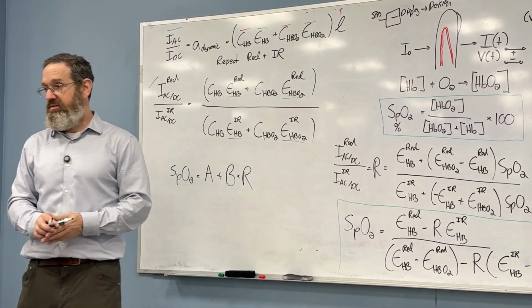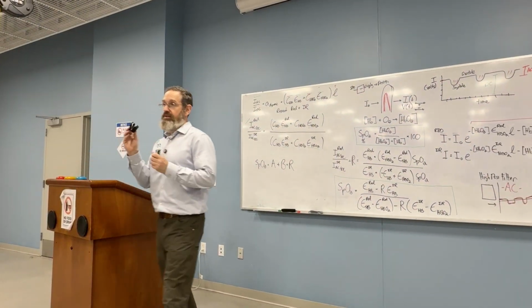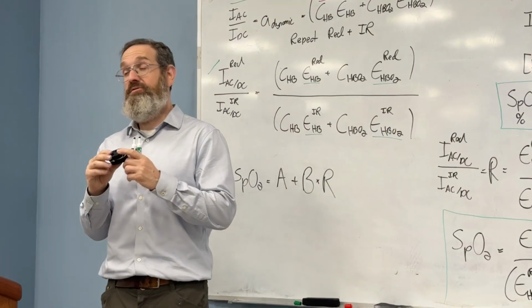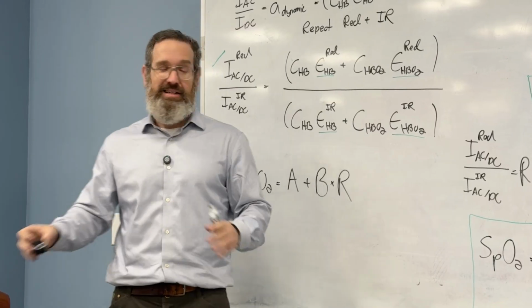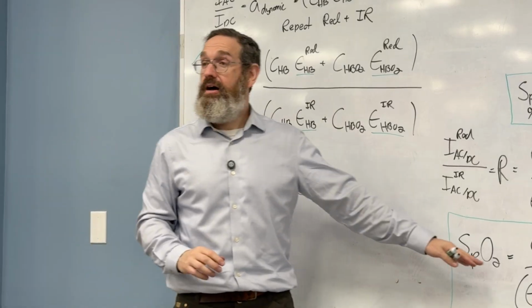For each pulse oximeter, they will calibrate it. And there are different ways. You'd have to use a gold standard and you'd calibrate it. So sorry, okay? But yes?